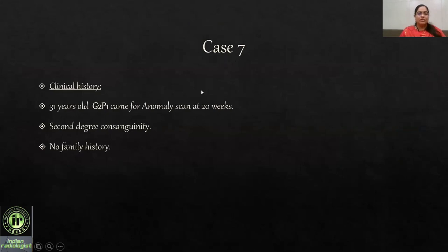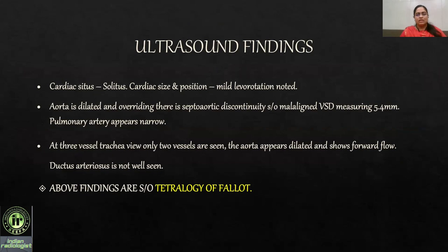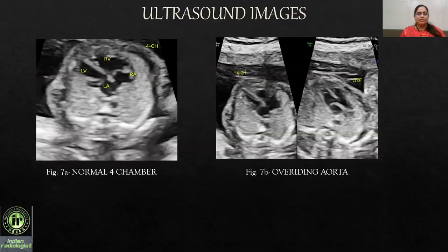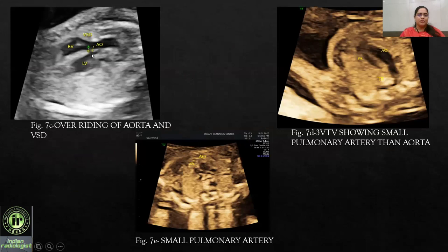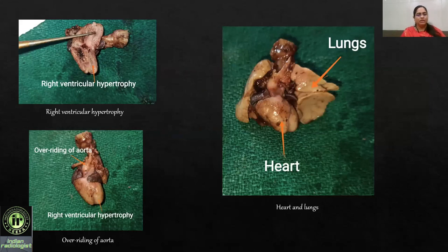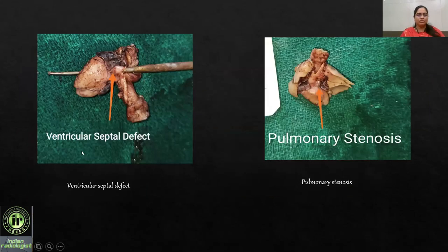Case 7: A 31-year-old G2P1 came for an anomaly scan with second-degree consanguinity and no family history. Situs was normal. There was septo-aortic discontinuity measuring 5.4 mm with the aorta dilated and overriding. Three-vessel trachea view showed the aorta appearing dilated with forward flow. The four-chamber view confirmed atrioventricular concordance. The five-chamber view showed septo-aortic discontinuity, and the pulmonary artery appeared very narrow compared to the aorta. This confirmed the diagnosis of tetralogy of Fallot. Autopsy confirmed overriding of the aorta, ventricular septal defect, and a small pulmonary vessel indicating pulmonary stenosis.